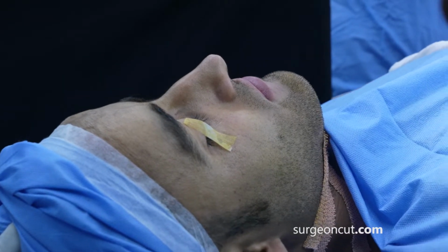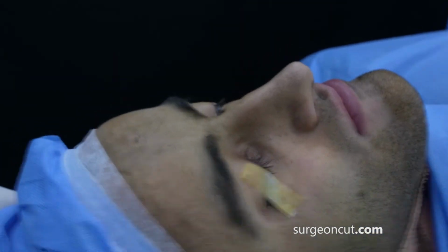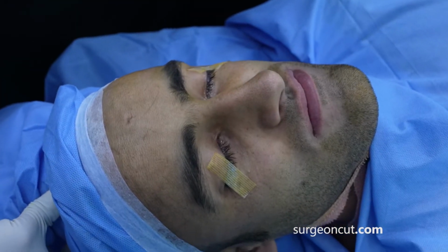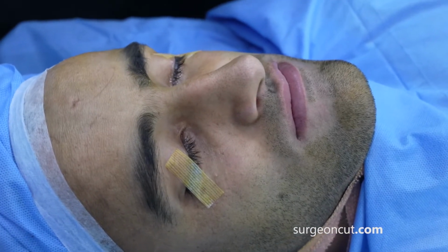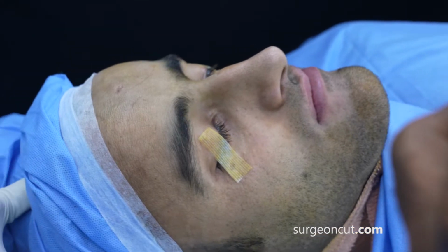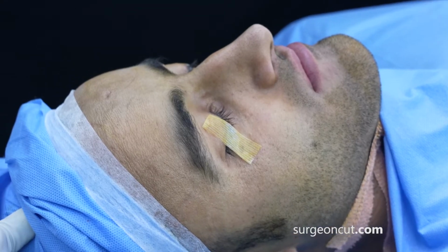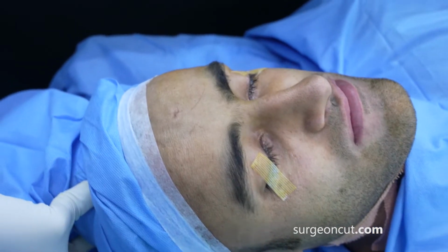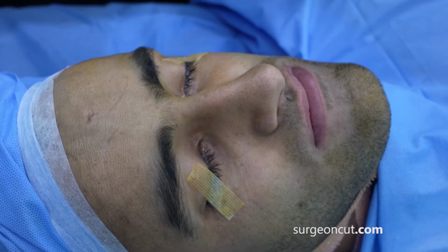Surgery for this patient. You can see the lower jaw sticking out. He's got an underbite as well. So we've planned an osteotomy on the upper jaw and also the lower jaw. We're getting the upper jaw forward by 4 to 5 millimeters, and downwards also by 3 to 4 millimeters. We made 2 splints, and we're getting the lower jaw back, more by rotation and less by bodily movement. This is going to change the middle third and the lower third of the face for this patient. We've given a submental intubation, and this is just before we start.